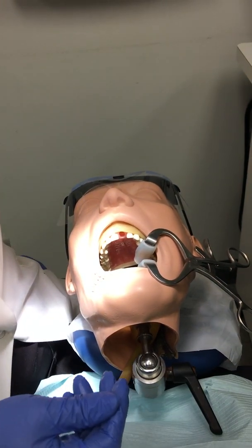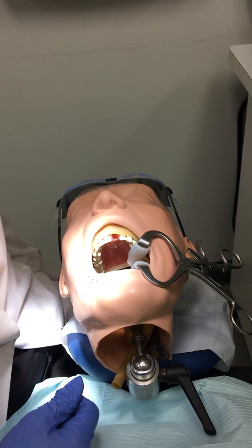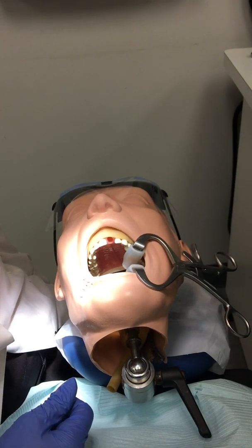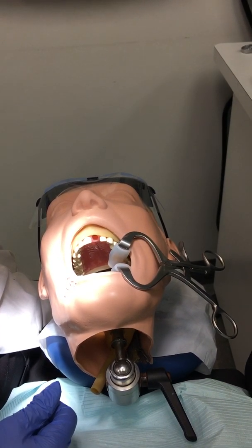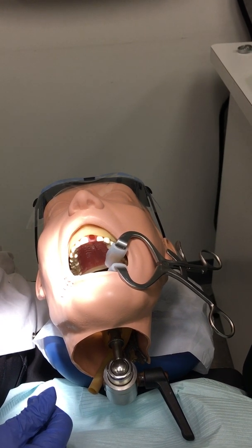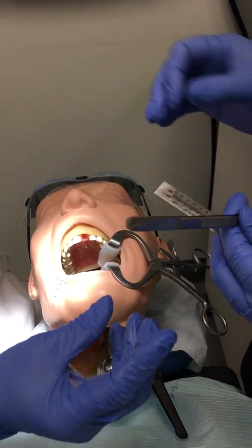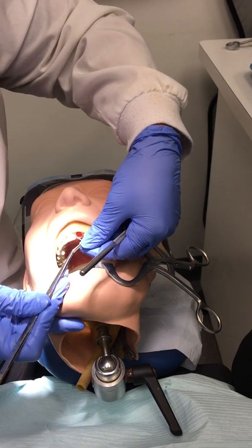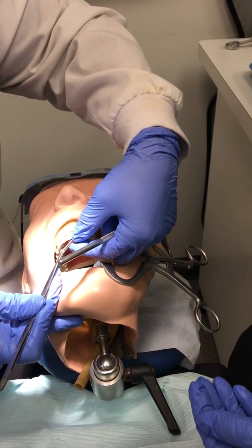The doctor will select a gutta-percha point as the master cone for each canal, if it is a multi-rooted tooth. The doctor will insert the cone into the canal to check the fit. Once the doctor is sure the gutta-percha fits snugly towards the apex, retrieve the master cone.